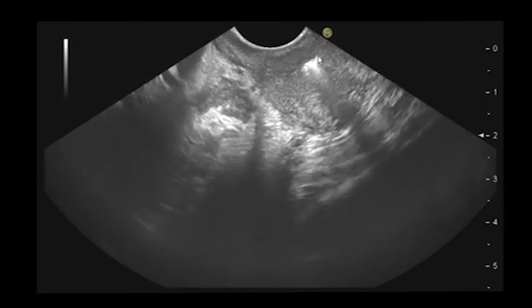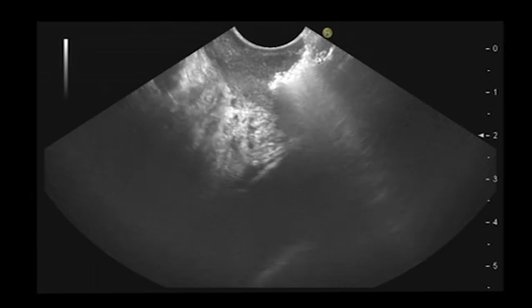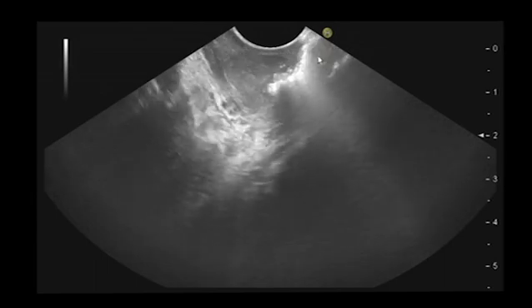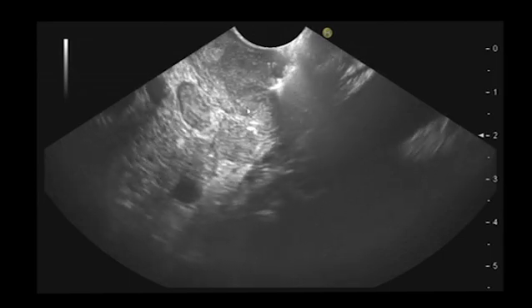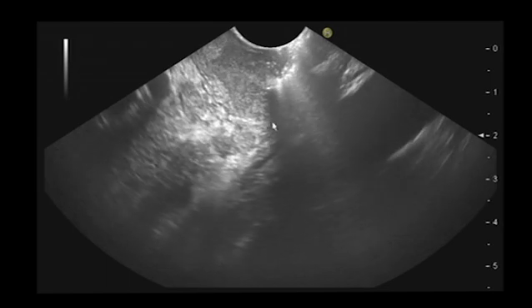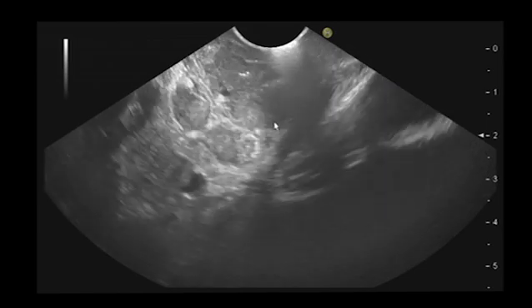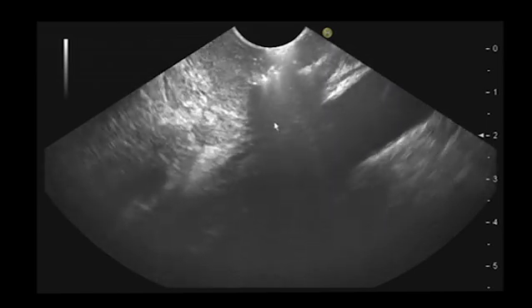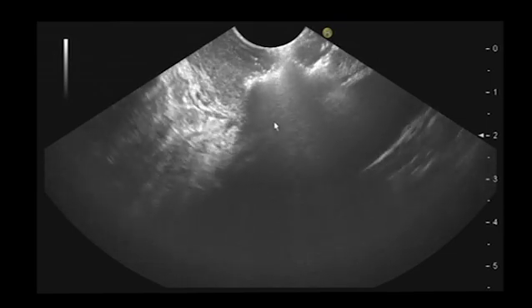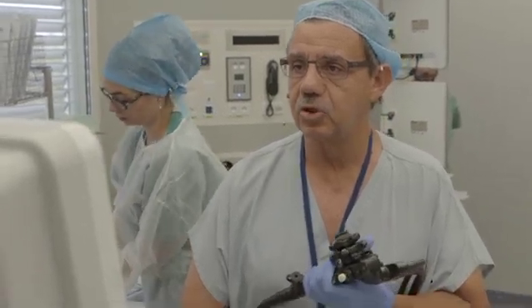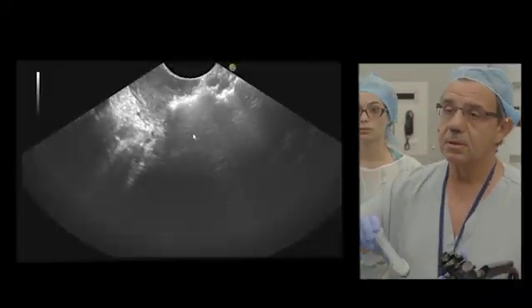Question from colleague: Do you think SonoVue is good for this kind of metastasis? Yes, you can do SonoVue, but in this case you can do it externally with the US — no need to use the endoscopic US. But here we have this mass developing in the stomach, which is probably the primitive tumor. Can you give me some water please, before using the needle? I will put some water inside the stomach, not too much to avoid regurgitation.